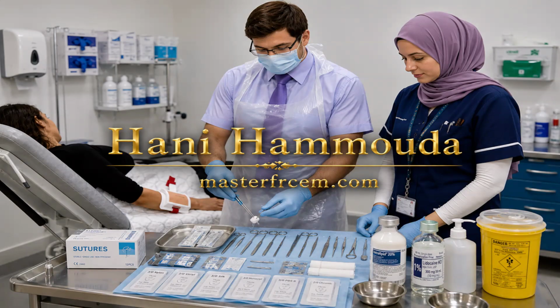Okay. Hello, sir. Good morning. I'm Dr. Rosimon. Nice to meet you. May I know your name and age, please? I need to close your wound by doing the suture. Is that okay with you? We need to do suture because your wound is deep and we need to close it. First, we need to clean it with normal saline inside and outside with betadine.